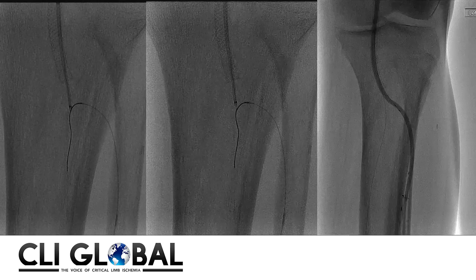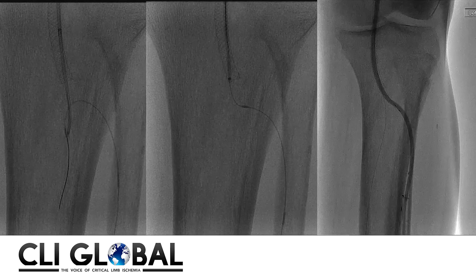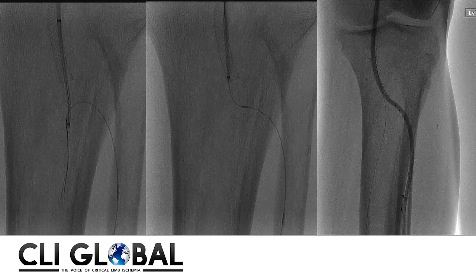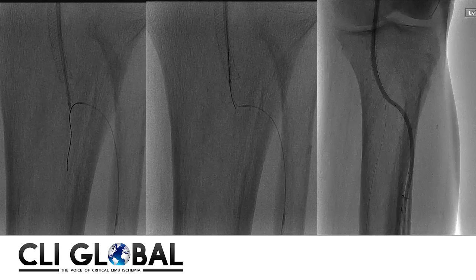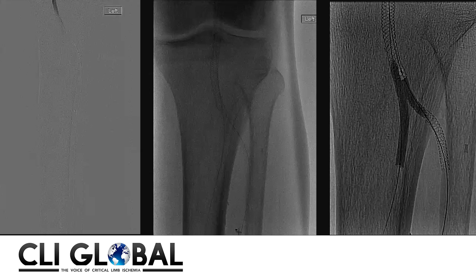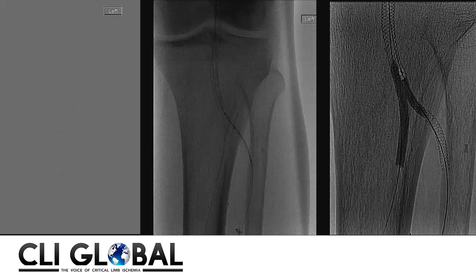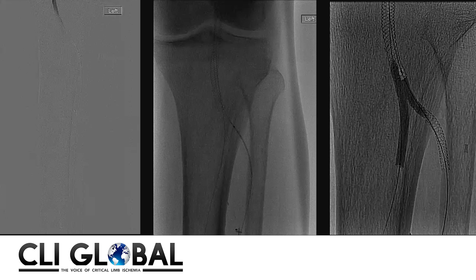Importantly, we had a wire securing our TPT trunk into the posterior tibial artery. The angiographic pictures clearly show that flow through the posterior tibial artery and TPT trunk is much better than the anterior tibial artery, which is clearly due to a flow-limiting dissection involving the ostium of the anterior tibial artery.